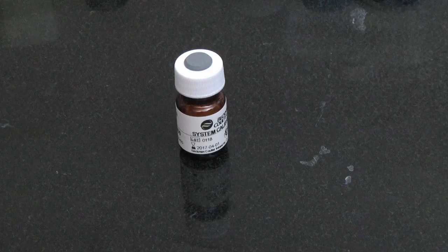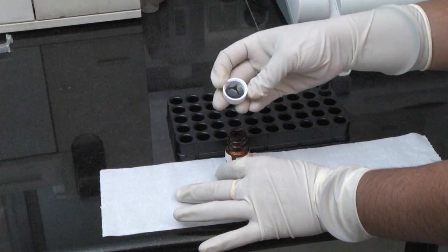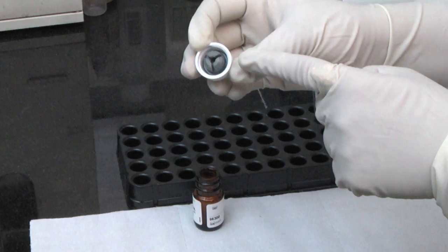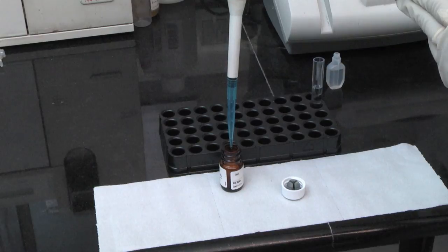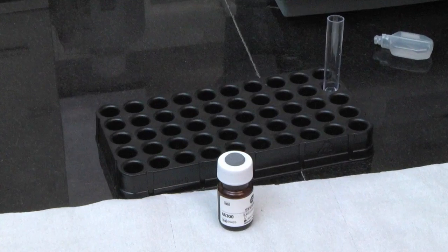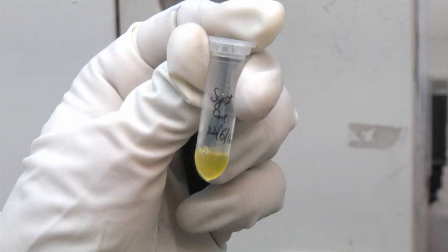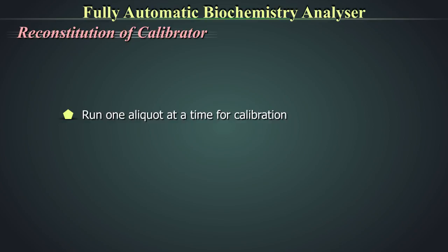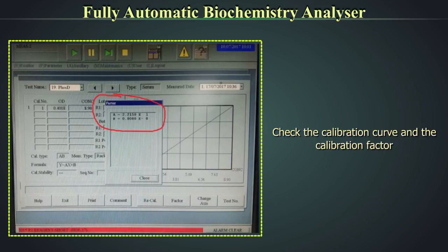Reconstitution of calibrator: Take out the vial from the refrigerator and bring it to room temperature. Open the vial and place the cap on the workbench gently, noting the calibrator powder adhering to the inside of the cap. As calibrators are expensive and last for a short duration, use them judiciously. Reconstitute the calibrator with 5 ml of injection water, close the cap, and mix gently by inversion. Keep it for 10 minutes, then mix again; wait another 10 minutes, mix, then distribute into aliquots and label them. Store aliquots in the freezer at −10 to −20°C. Run one aliquot at a time; remove from the freezer, thaw, use, and discard the rest. Check the calibration curve and the calibration factor.